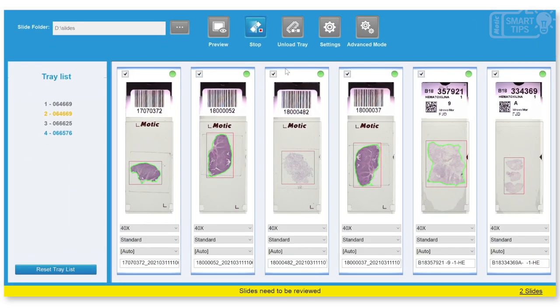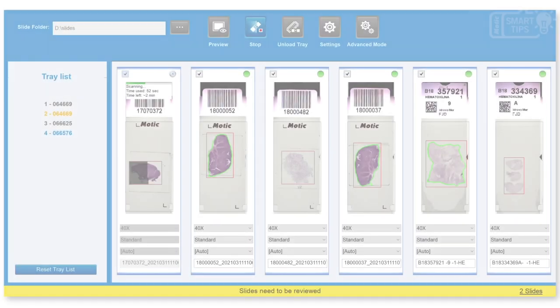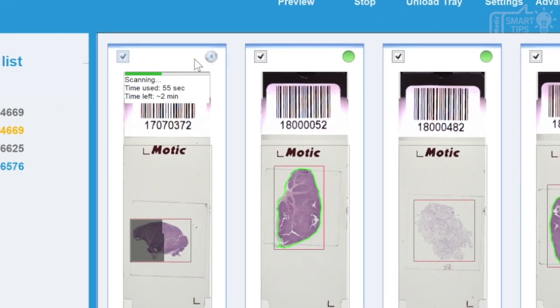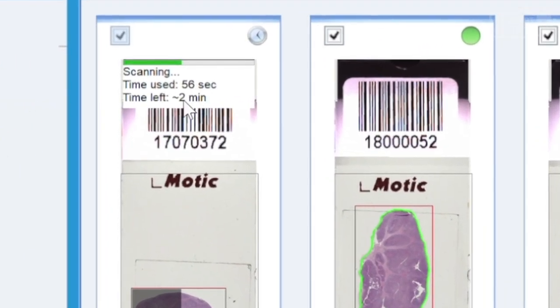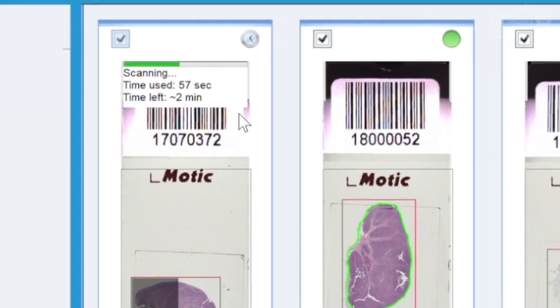And this is how the scanning process begins. As you can see, while it is scanning, you can see the time used and the time left.